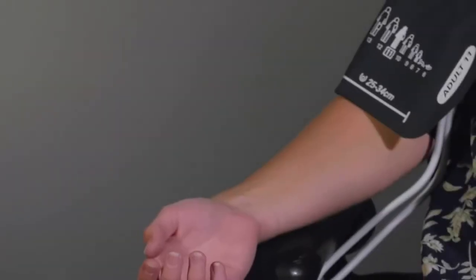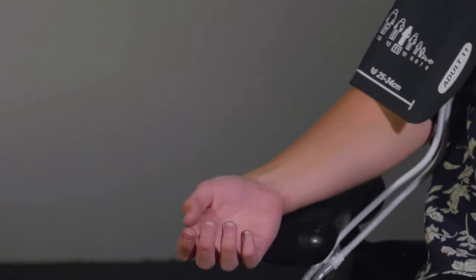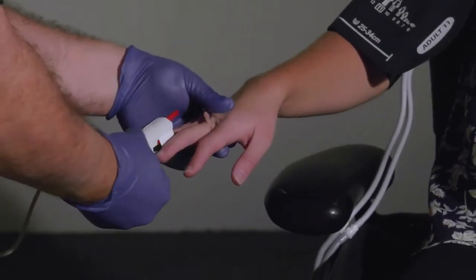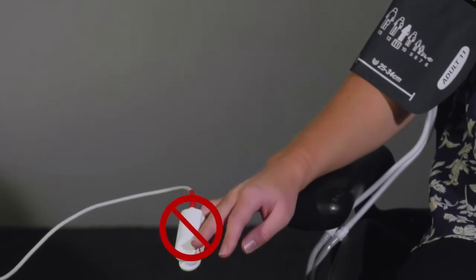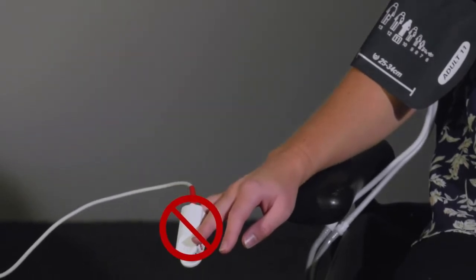Do not select an SpO2 site on the same limb as the NIBP cuff. Inflation of the cuff will cause the SpO2 values to read incorrectly.